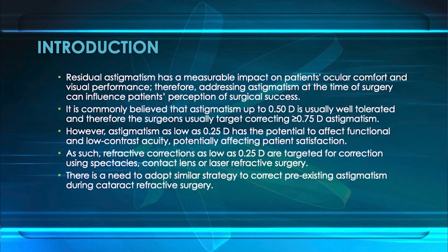And for our section, we're going to talk about treating astigmatism, taking that to the next level with LENSAR and Ally in the future. So as an introduction, we all are very familiar that residual astigmatism has a measurable impact on a patient's visual performance after surgery. We know that addressing the astigmatism at the time of the surgery influences the patient's perception of whether their surgery was a success or not.